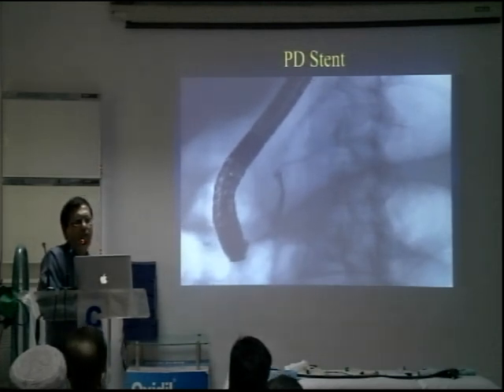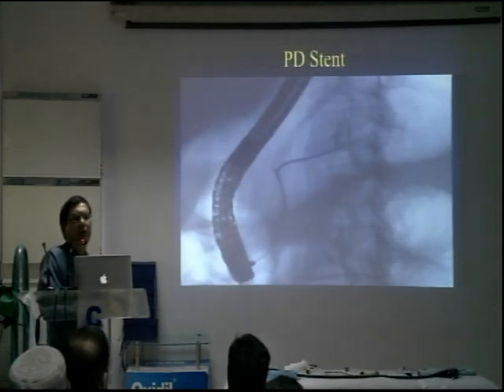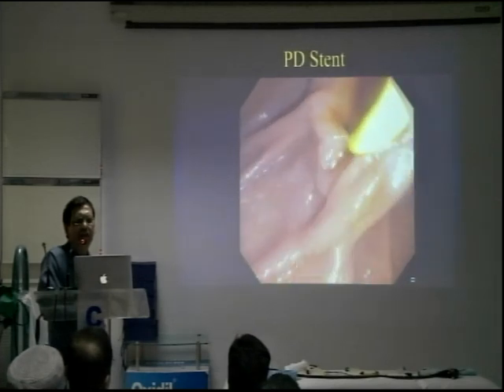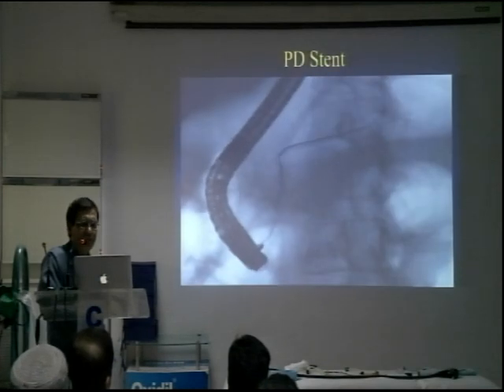And also, when you put a smaller stent, get rid of that loop before you put the stent. Sometimes the wire can get stuck on that. So here, you can see this is a stent in there. I think it's a pigtail. I don't remember.